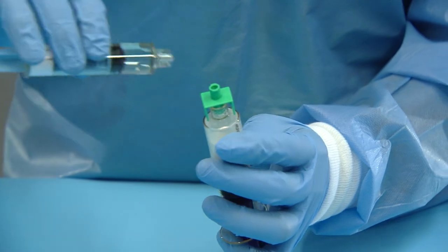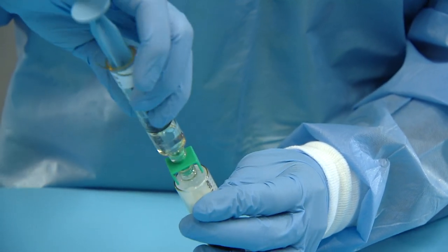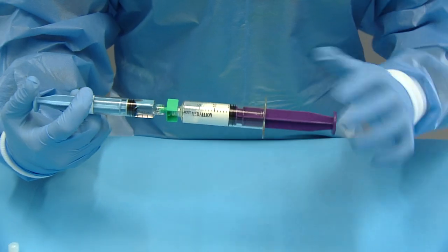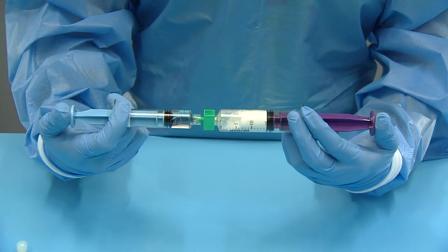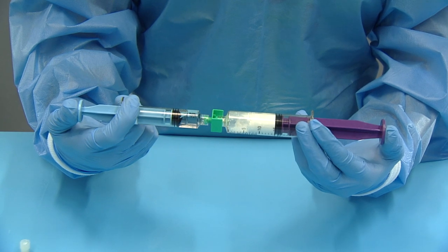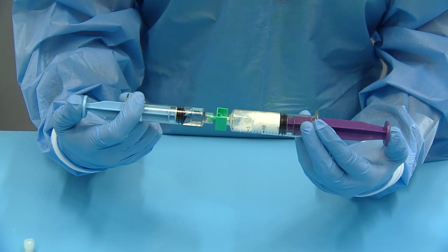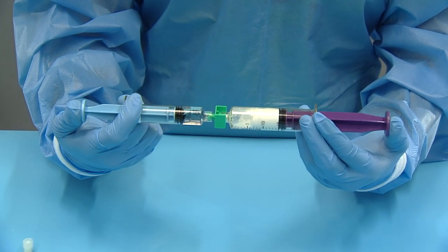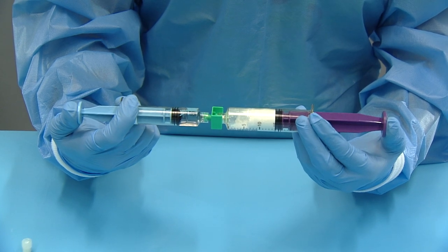Connect the syringes together using the lure lock connector. Hold the syringes vertically such that the saline is on top and rapidly inject the saline into the powder syringe. Hold the plunger down briefly to ensure that pressure does not push the saline back.